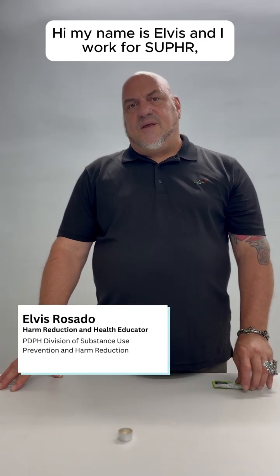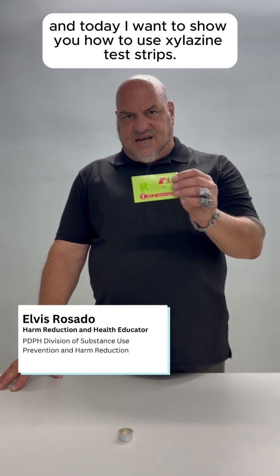Hi, my name is Elvis, and I work for SUPHR, and today I want to show you how to use xylazine test strips.